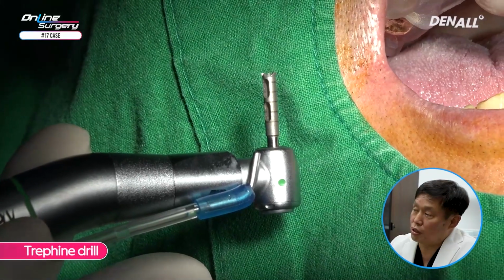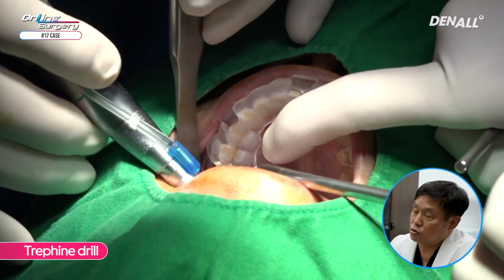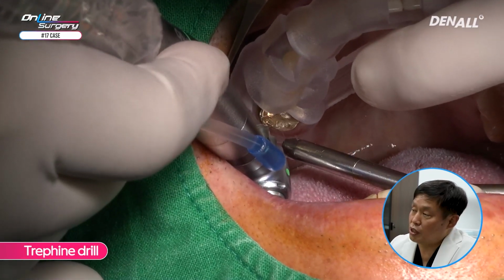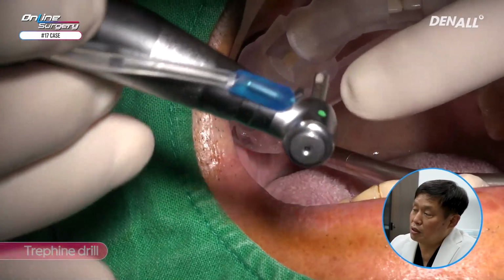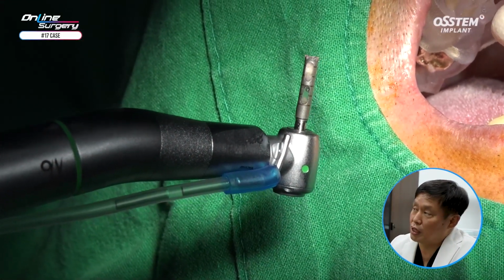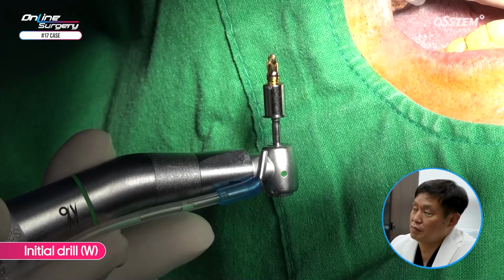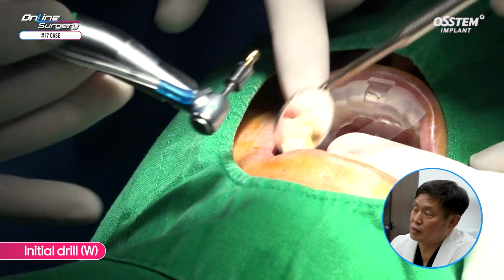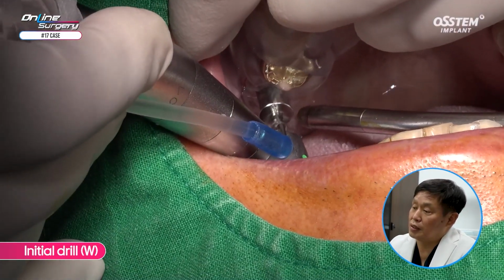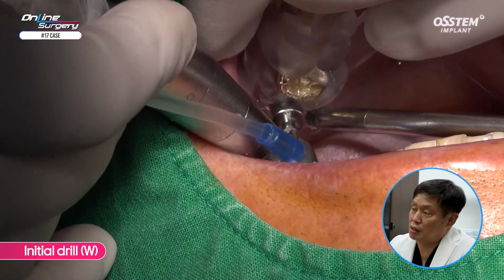For biopsy, trephine drill was used. In the area where socket preservation with AOS graft material was done, I used a trephine drill to get specimen to check how much healing was done. You can see that the specimen has been gained. Initial drill was used for drilling. Gold rim wide type initial drilling was done.